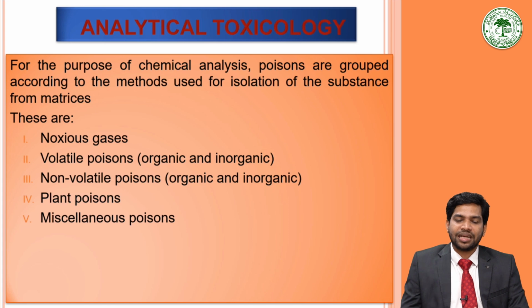The first step in analytical toxicology begins with the extraction of the drug or poison from the large amount of biological components such as proteins, lipids, nucleic acid, and the membrane. Like the way when we collect the sample, we collect either the gastric lavage sample or the blood sample, or from the postmortem examination, various tissues, and everything we send to the toxicology laboratories.